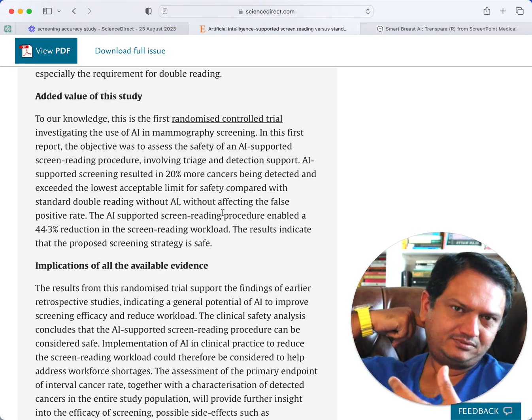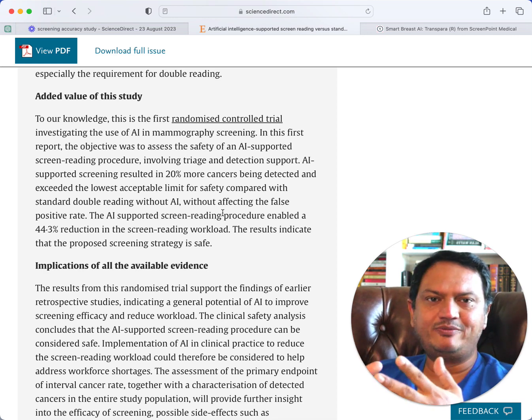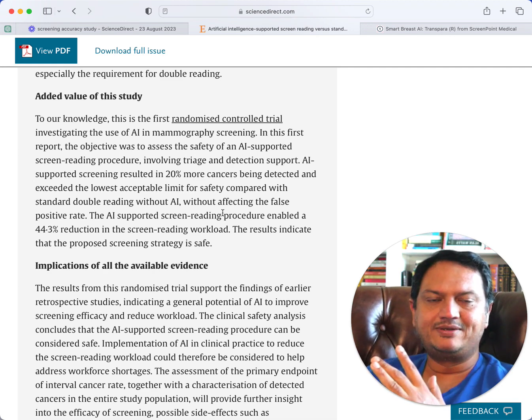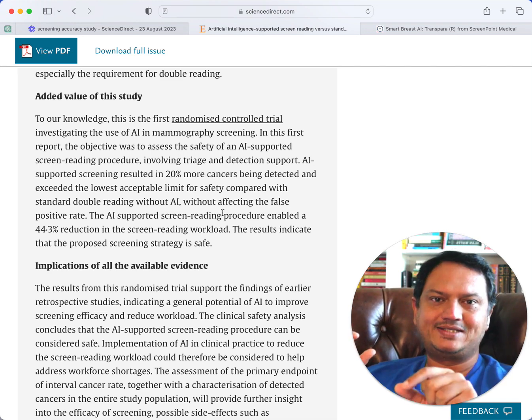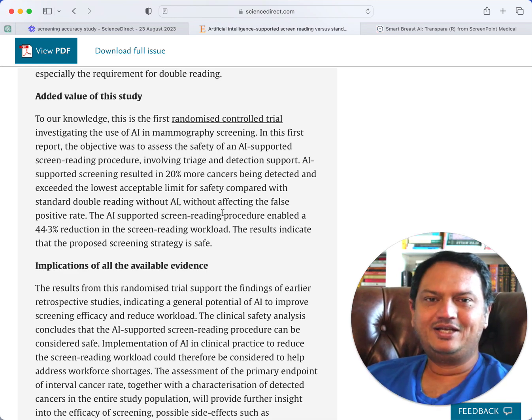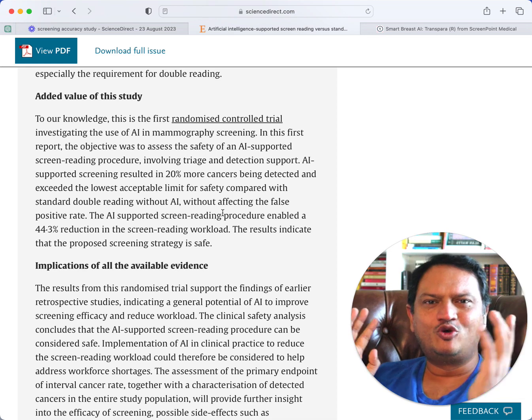Almost or less. So if you're doing mass public screening or population level screening, the outcome is something very small. Out of these 80,000 women, about 500 or less eventually turned out to have something cancerous, malignant, right? So picking those 500 out of 80,000 is a very tedious task. And it's so boring and tedious that they have two radiologists look at the same image because one may miss it. You are looking at hundreds of images every day because you have so much workload.